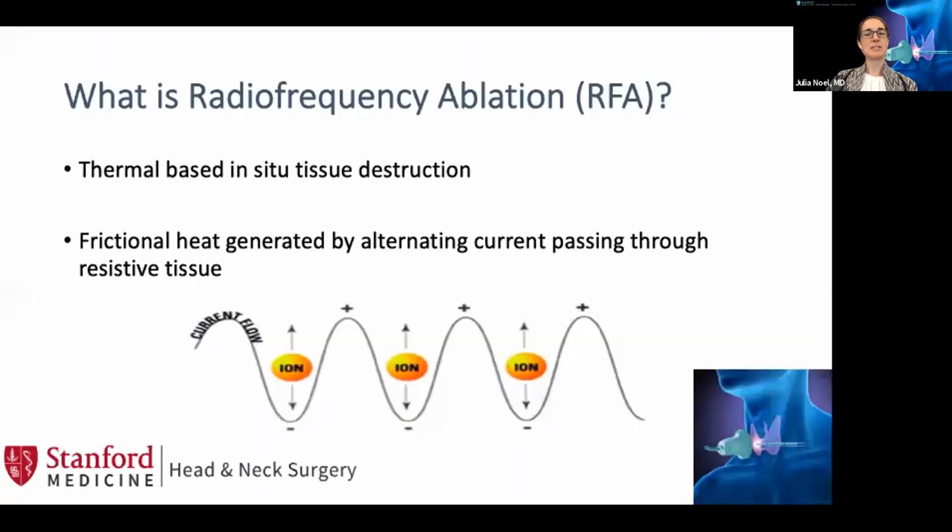So radiofrequency ablation is a technology that's actually been around for quite some time to treat solid tumors in the liver, kidney, bone, and lung. And although it's relatively recent that we've used RFA for thyroid tumors in the US, we owe a great deal of credit to colleagues around the world, and especially to the earliest pioneers in Korea for really bringing this to the forefront of our attention and providing so much of the data that's led to its international adoption.